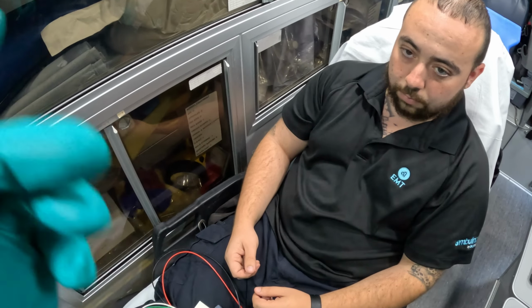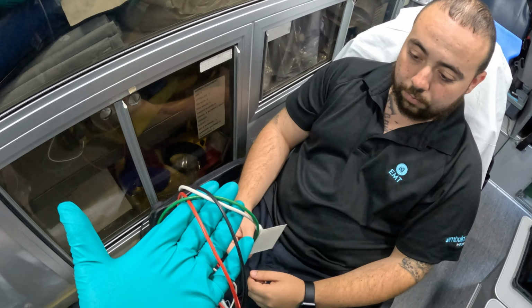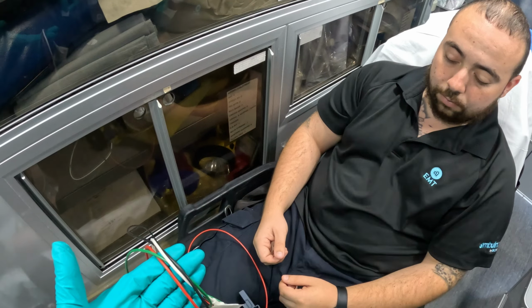So for the purposes of a 3-lead, right, these can go on the torso, on the limbs, it doesn't really matter. If you're doing a 12-lead, by convention, the textbooks will tell you these have to go on the limbs. Why? Because if you place them on the torso, you may over augment, right? But it's not a big deal. Just ask what the medic wants. But I'm going to show you the way it's described traditionally in the textbook.